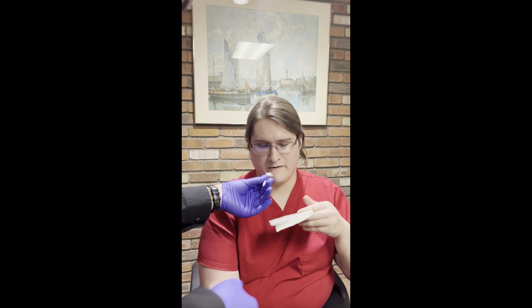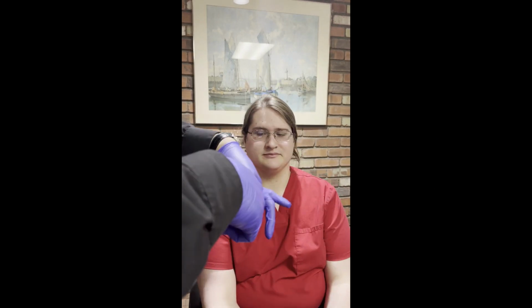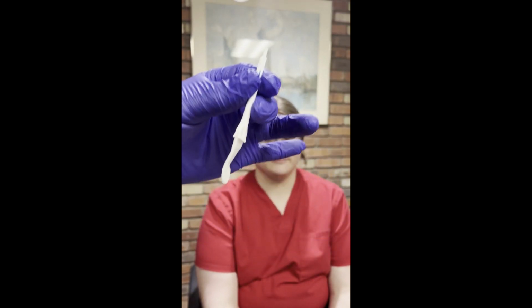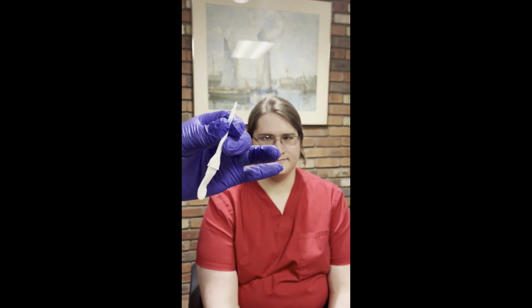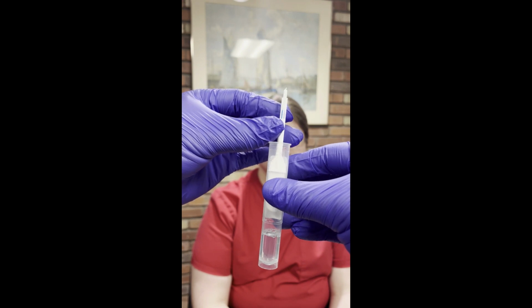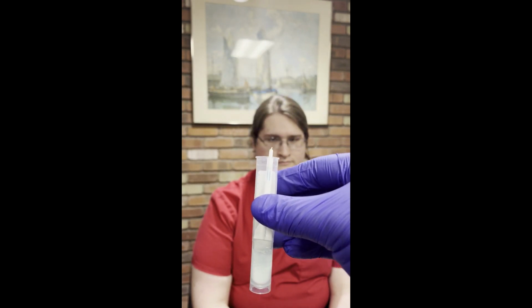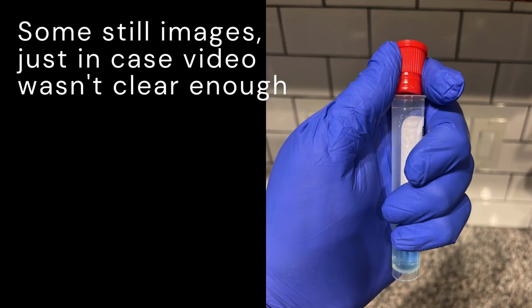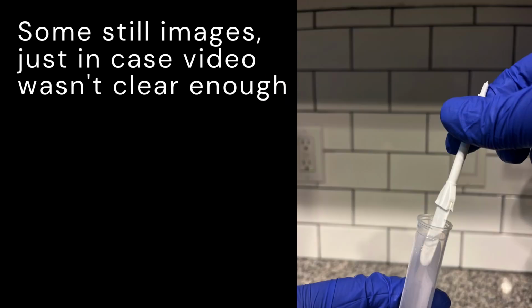So after making sure that you have enough specimen on the applicator by making sure the little window is blue, you're going to insert it into the specimen transport tube. So you open it up, pop the top off, insert it gently into the tube, make sure not to splash any buffer anywhere, and then you're going to close it nice and tight. By the way, you will hear an audible snap. That will let you know it's properly closed.